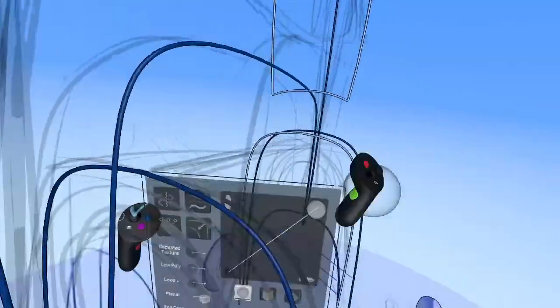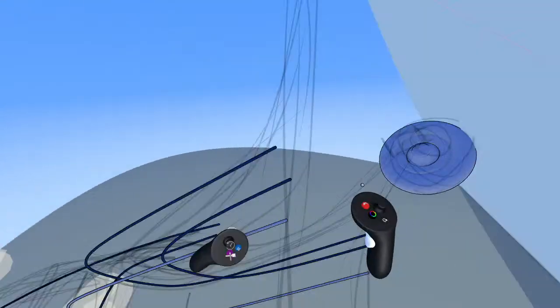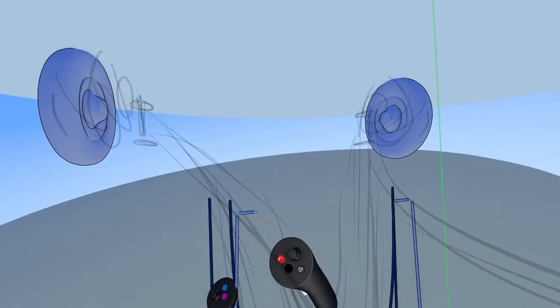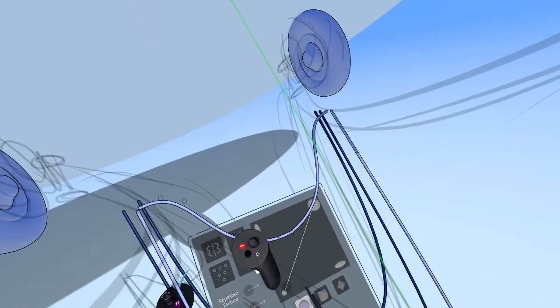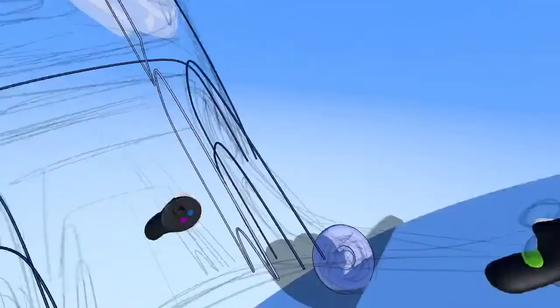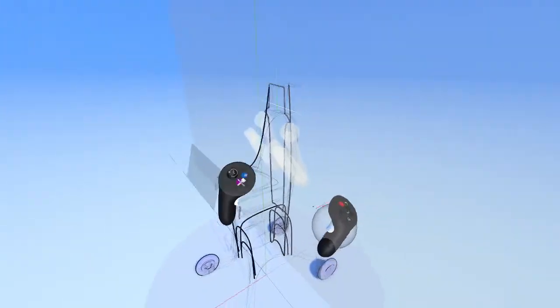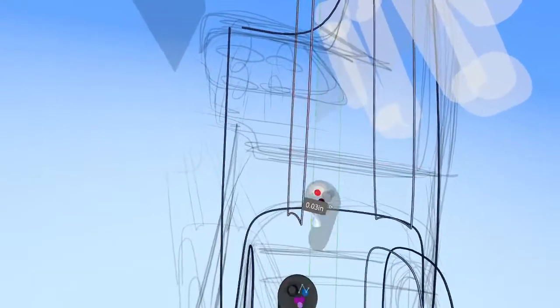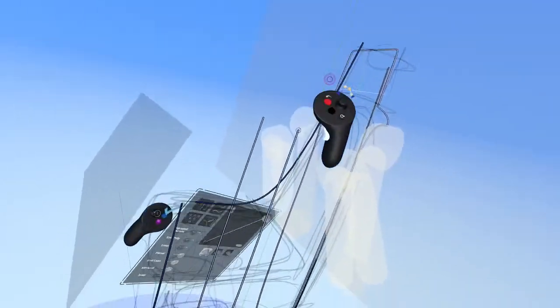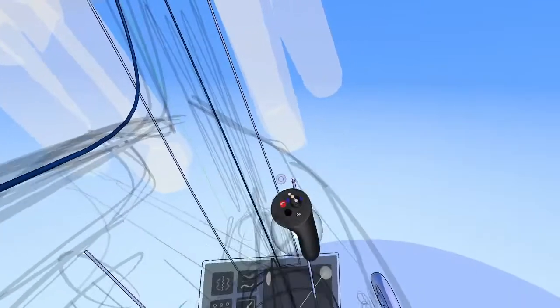Just doing a few odds and ends things here. Oh, and the bottom here. So I think I want a flat spot and then have that curve in. All right, cool. Good to go. All right, I lied to you. We're going to do another section over here. So I'm just going to duplicate this over and shift it up. And because we already have the line, just put this guy in edit mode and add the detail like this.